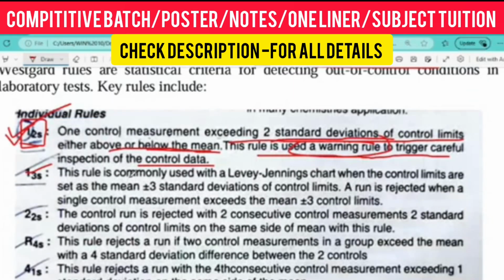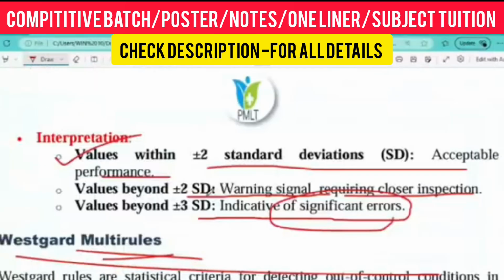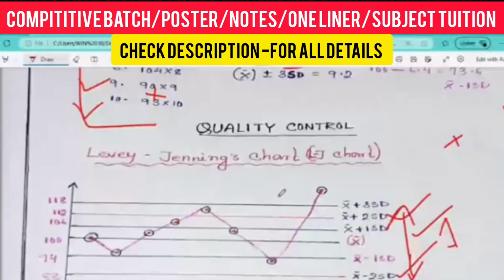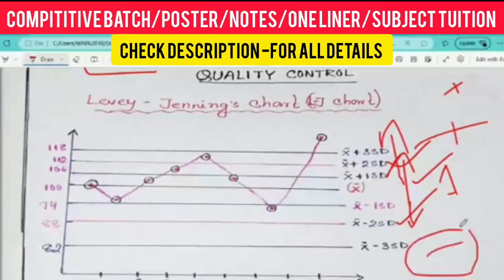Second, 1 3S. This rule is commonly used in the Levy-Jennings chart when the control limits are set at 3 standard deviations from the mean. A run is rejected when a single control measurement exceeds the 3S control limit. 1 3S. Getting my point? 1 3S means that if any level crosses either positive 3S or negative 3S, even a single time, we cannot take the result. It is rejected. Understood? So the second rule we have understood.